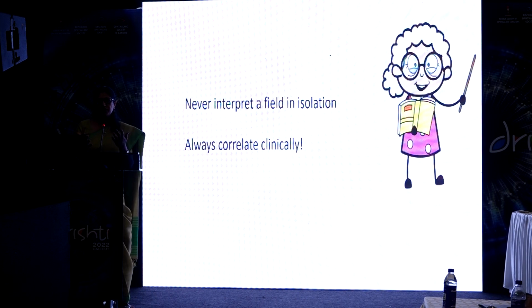Sometimes when you see both fields together, you'll realize that this could probably be a neurological field and not a glaucomatous field.